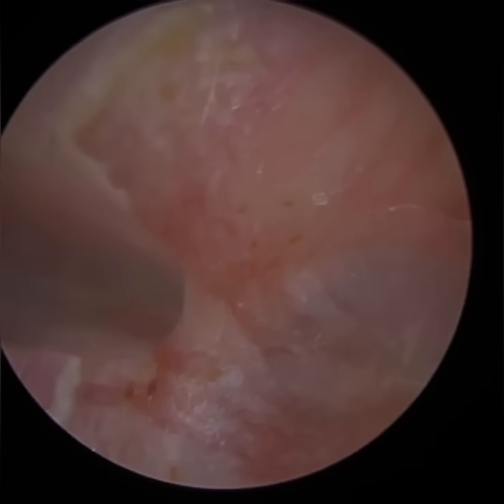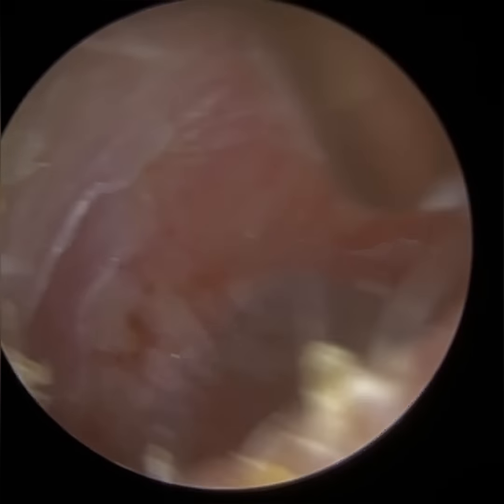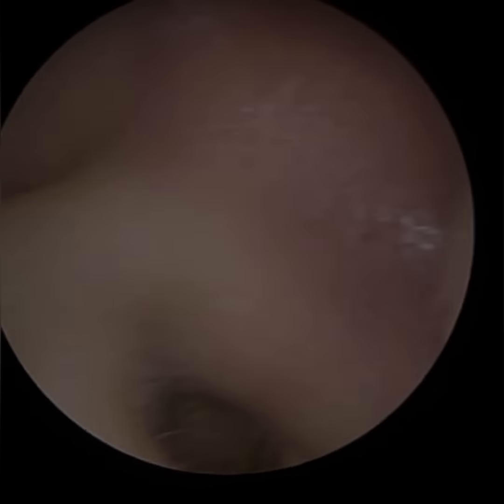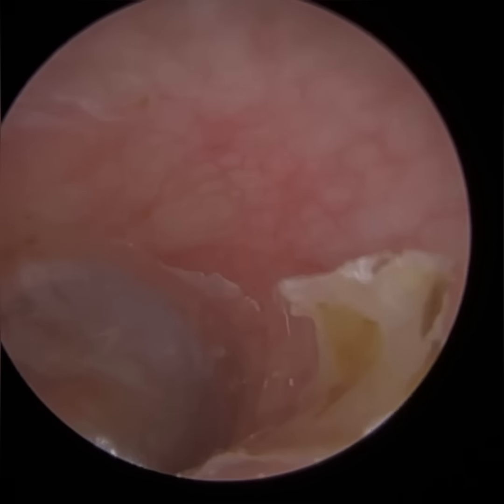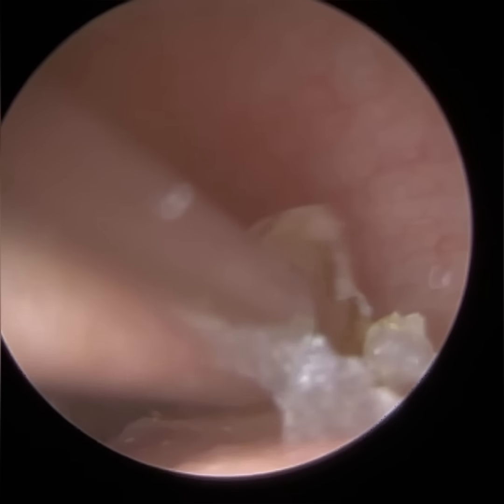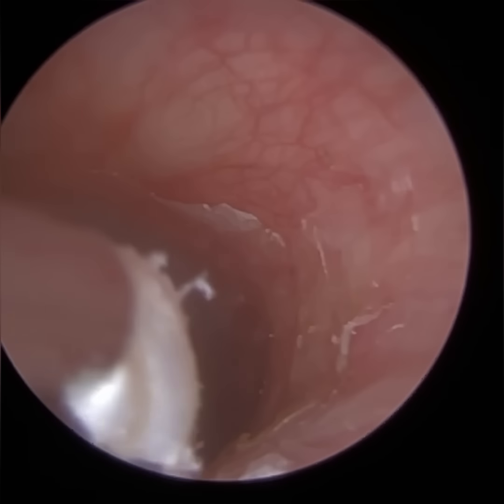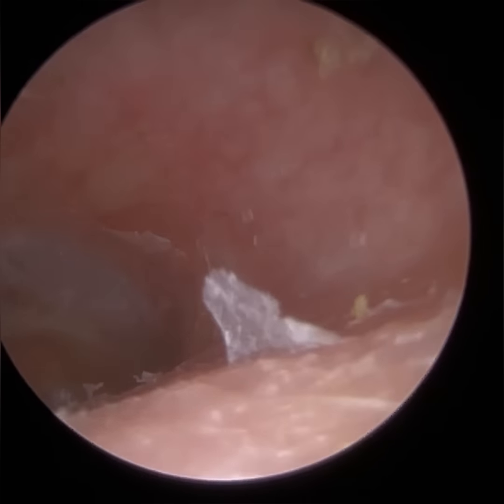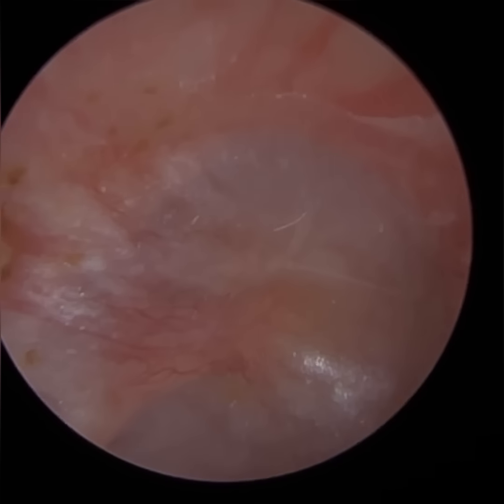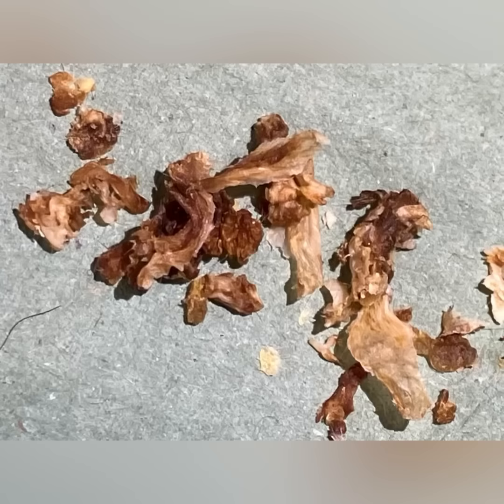There are always a few comments — serial offenders, really — who moan about little pieces of wax here and there. On the screen it looks massive, but the ear canal is less than a centimeter in diameter — and often much, much smaller. With the waxscope we've got speculae that are 3.5 millimeters internal diameter, but incorporating the wall thickness the external diameter is about 4.7 millimeters — so we're having to stretch and force the ear open. That's all the skin and keratin, as you can see — quite a lot.